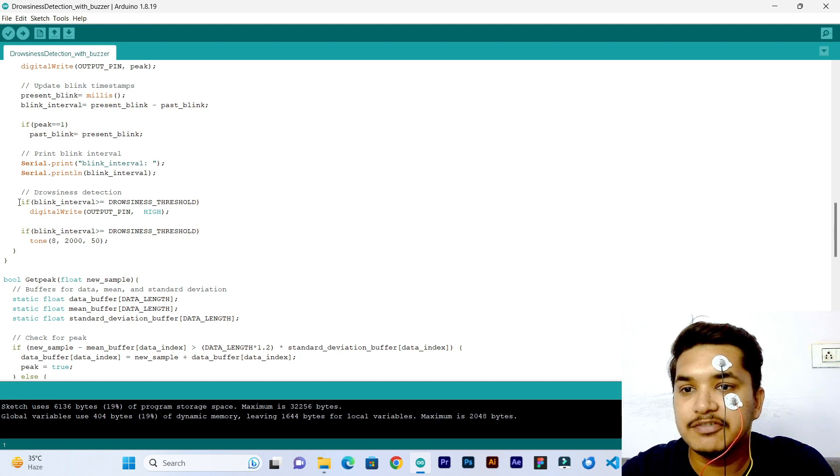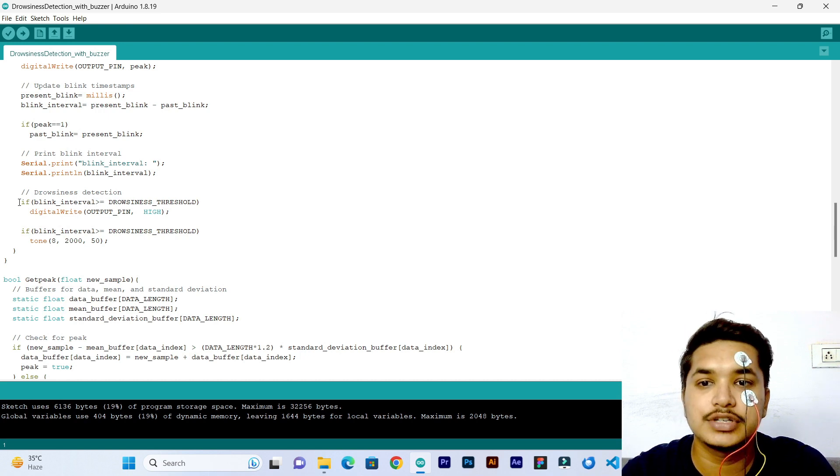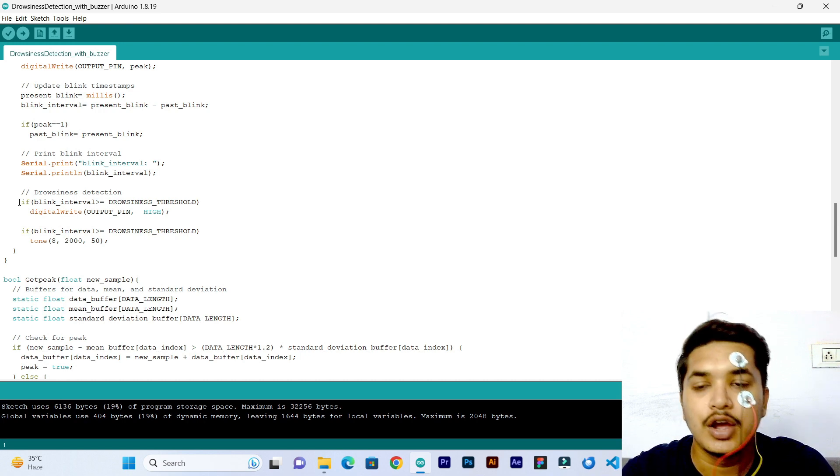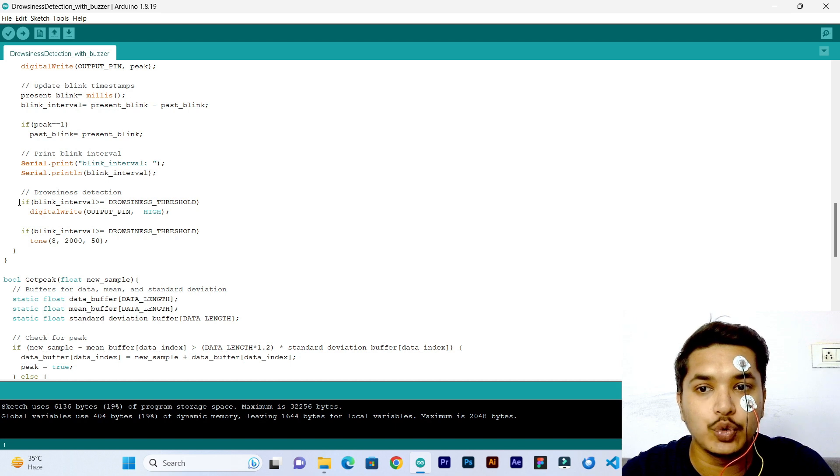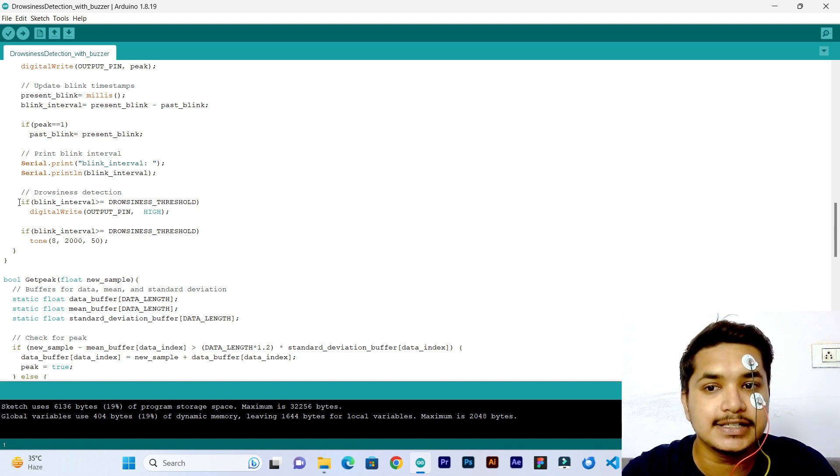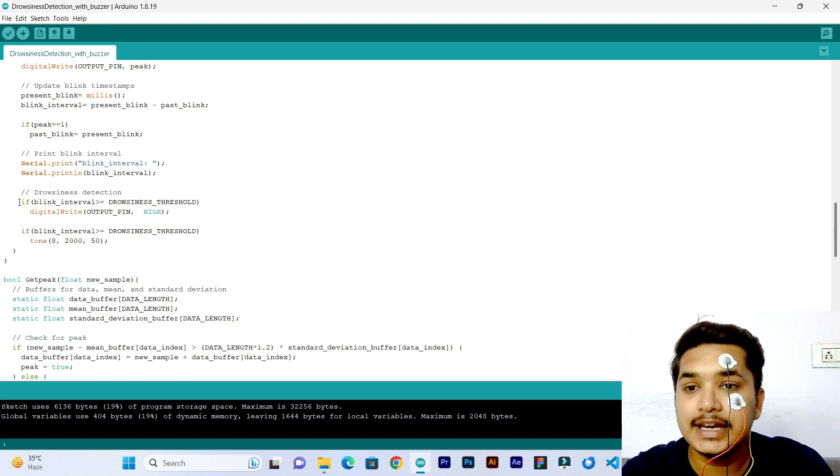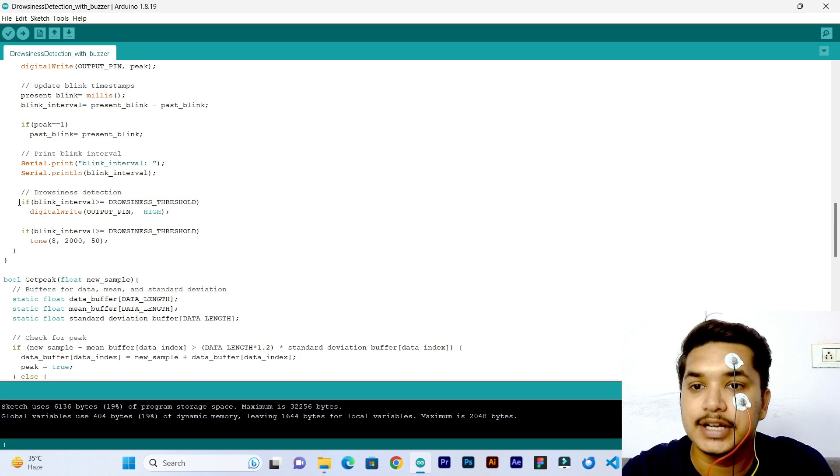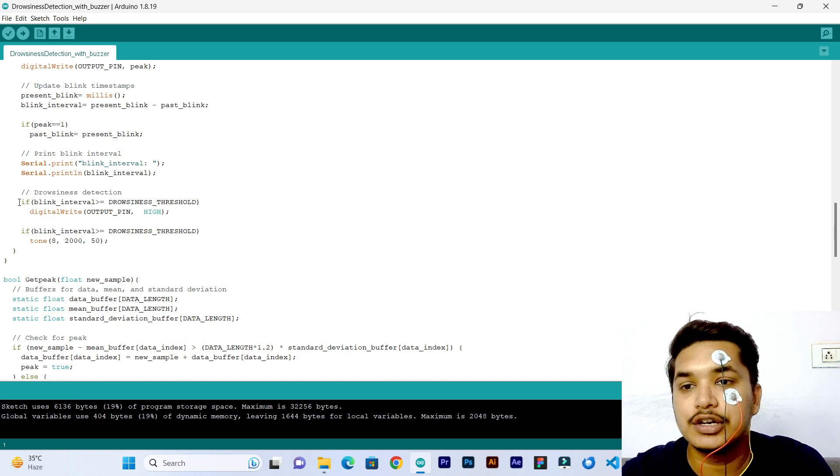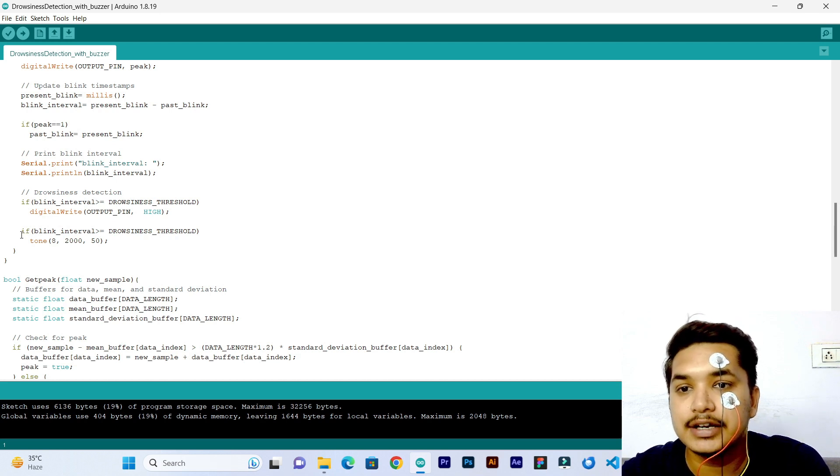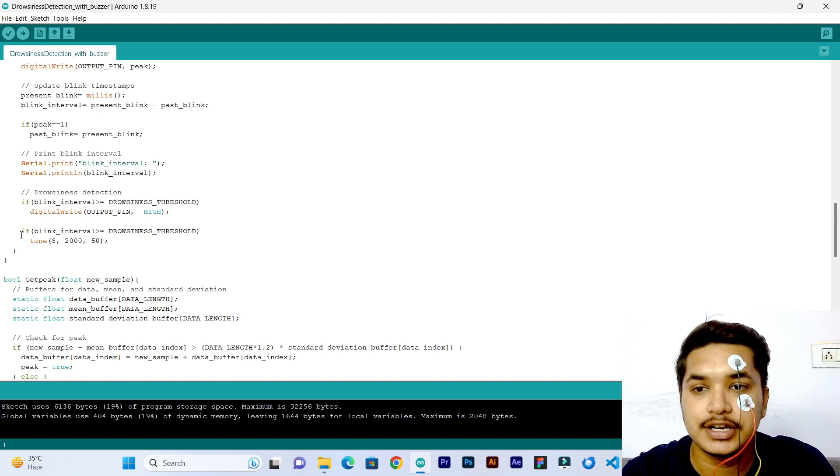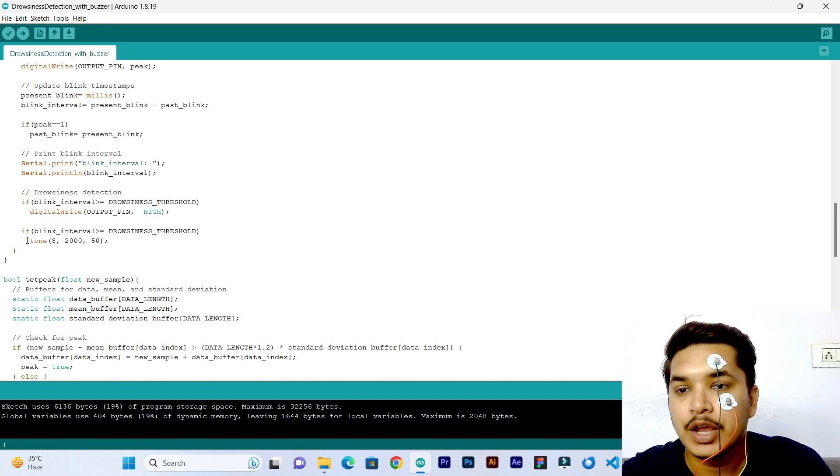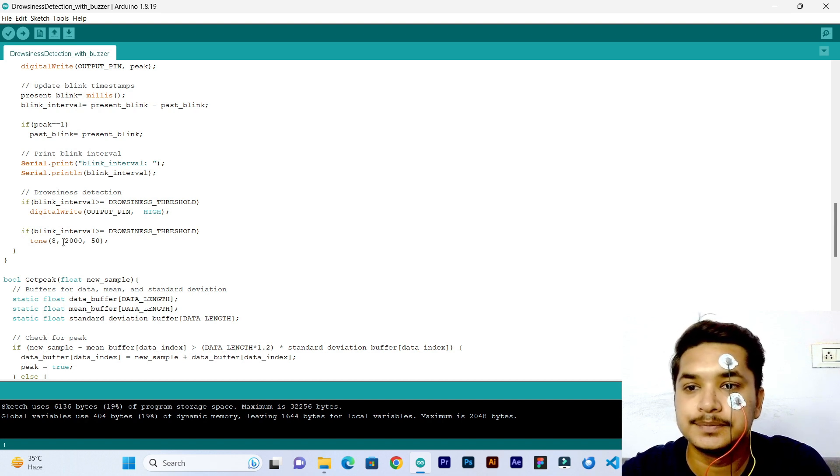If blink interval is greater than drowsiness threshold, which means the time between the two eye blinks, if it is greater than 6 seconds, then the LED at output pin 13 will glow. And again, if blink interval is greater than drowsiness threshold, the buzzer will be on, which is connected at pin 8.